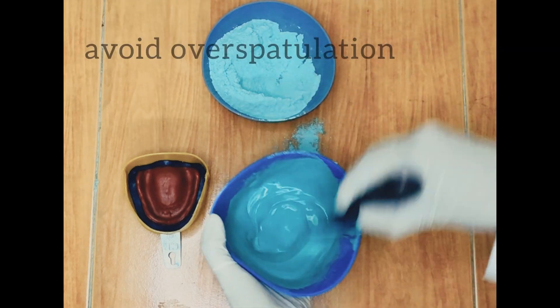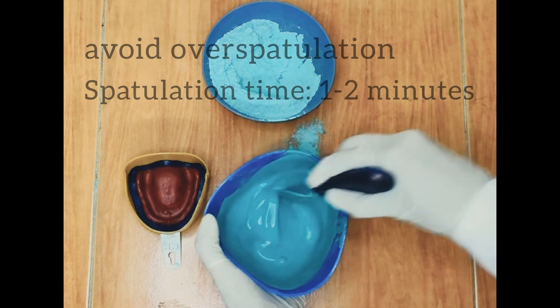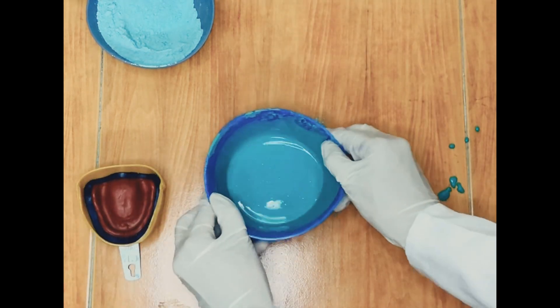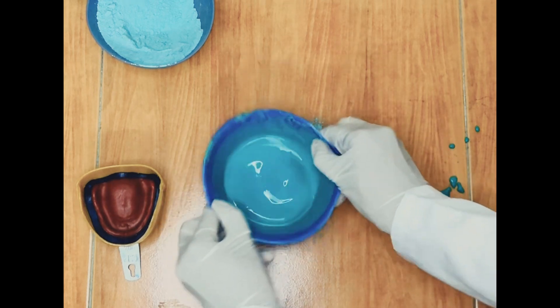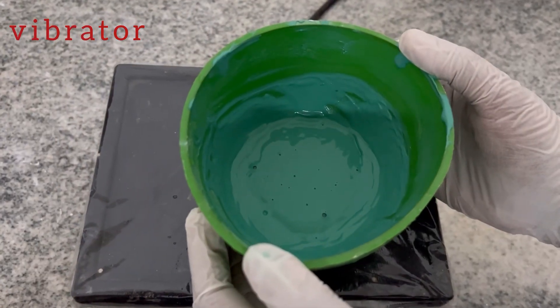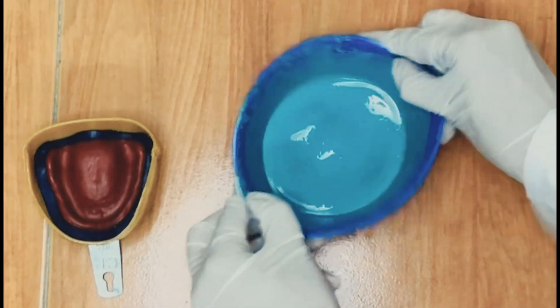Also avoid over-spatulation. Over-spatulation causes the formed gypsum crystals to be broken. These broken crystals act as additional nuclei for crystallization, affecting working and setting time. Air bubbles incorporated during mixing can be removed by tapping on the workbench or by using a mechanical vibrator. A high-frequency, low-amplitude vibration is desirable. Avoid over-agitation as this can whip more air bubbles into the mix.